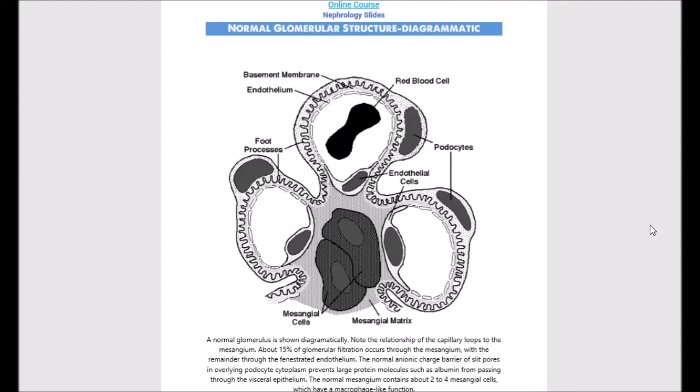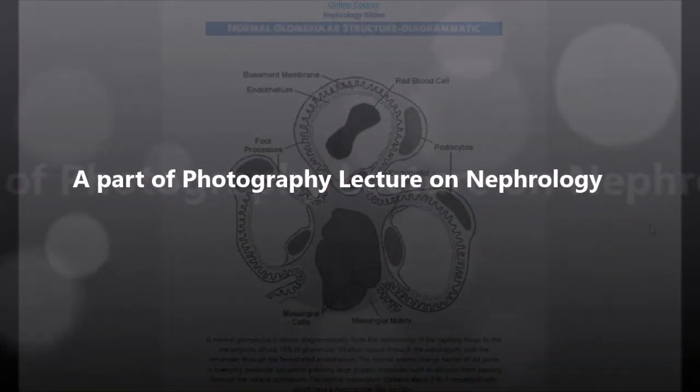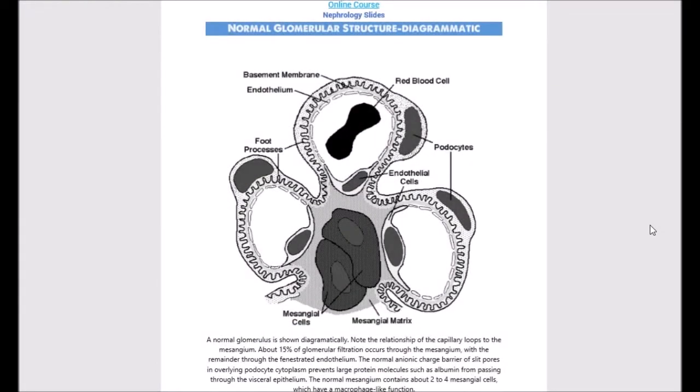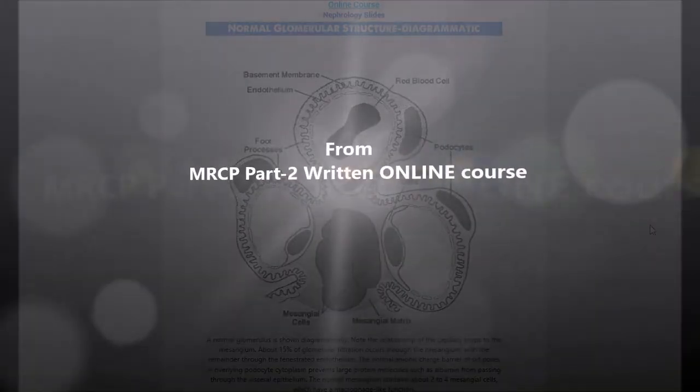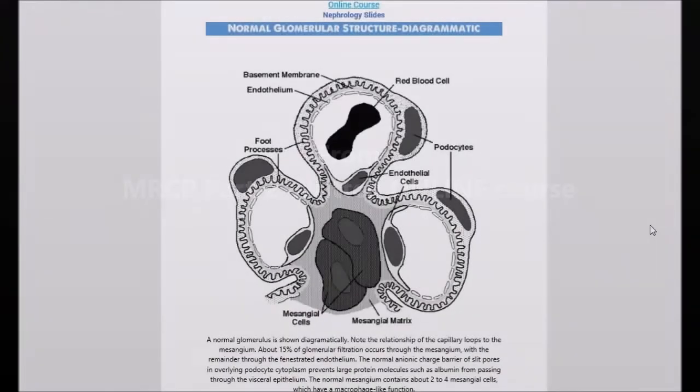And one of the important lecture discussions here: some of the photography and some of the slides in the nephrology system. Questions will come up, and some of the slides will be embedded into different questions.